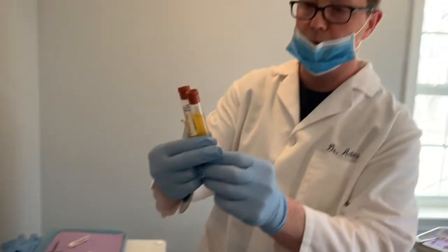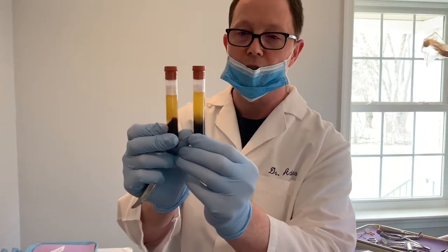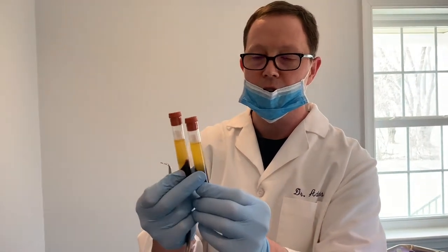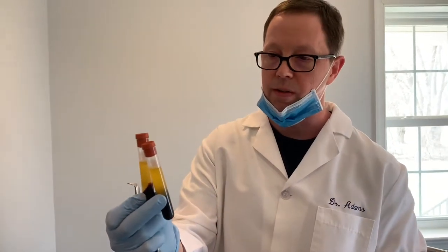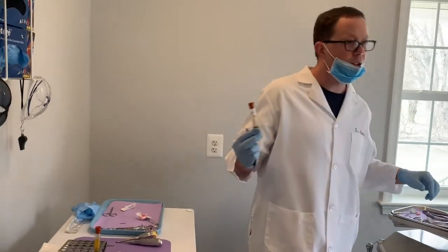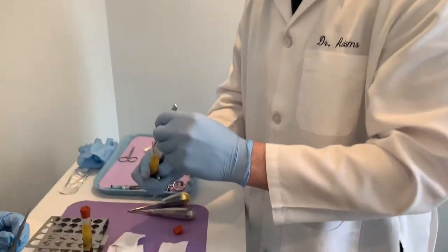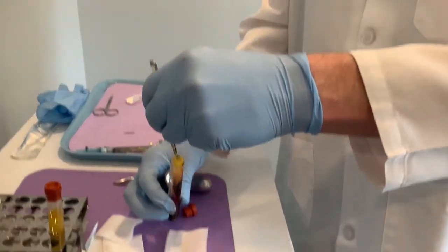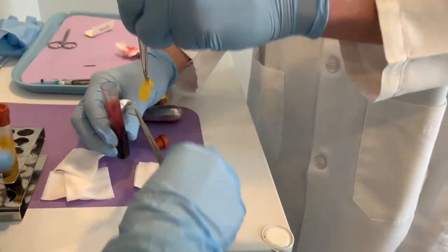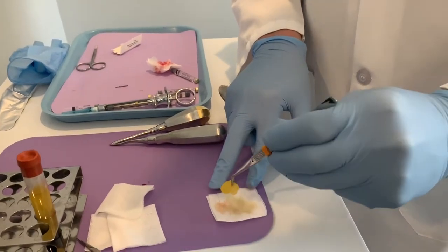Okay, we're going to come over here to where the platelet-rich fibrin is. These are the two vials of blood that we drew here. And you can see that there's two layers, basically, the yellow layer on top and the red layer on the bottom. The yellow layer is essentially what we're after. It's a mixture of white blood cells, platelets, fibrin. There's a lot of bone growth factors in there. And we're going to go ahead and tap into one of these. Lift this up, get down there and close. And we want to get the red part of it off. This stuff is very fluid, and we want that fluid.